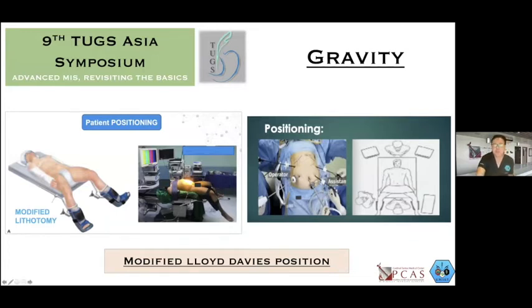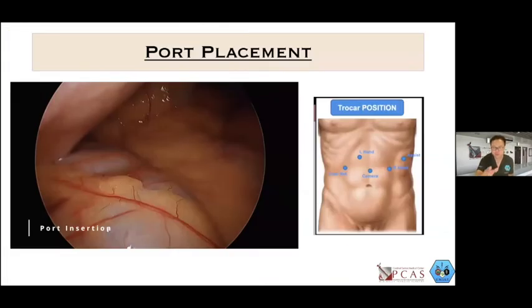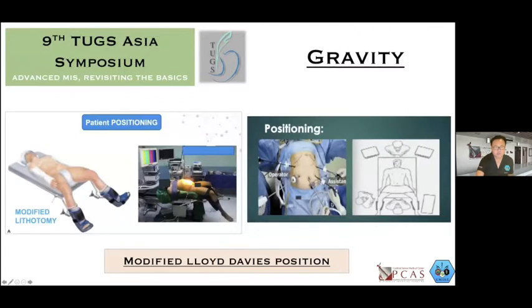Depending on the upper GI procedure that you would want to do, the surgeon would either stand on the right side of the patient in between the legs of the patient or the left side of the patient. In the majority of our upper GI surgeries, be it for gastric cancer or for hiatal surgeries, I would always stay in the middle of the legs of the patient for me to be able to have a better view and a better approach on the different positions of the patient.